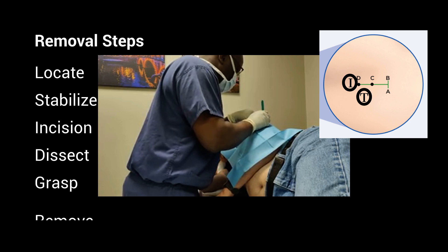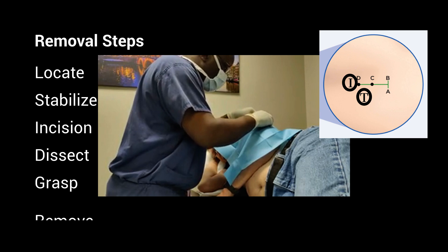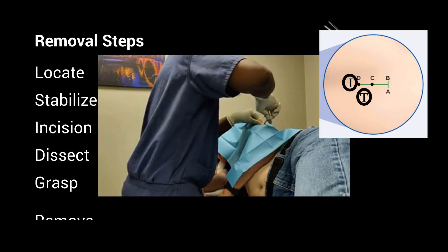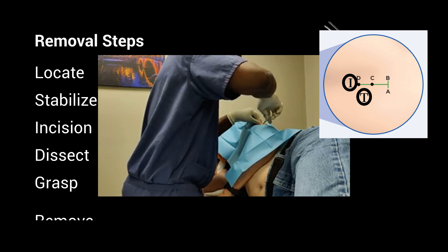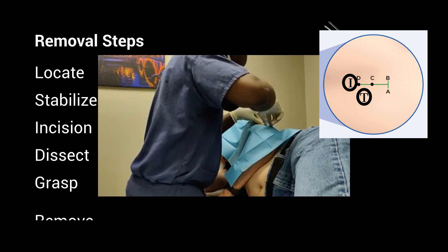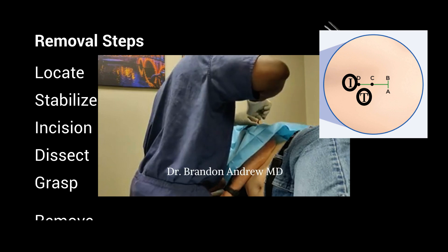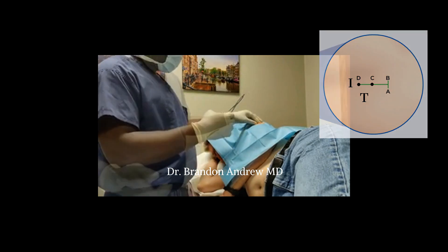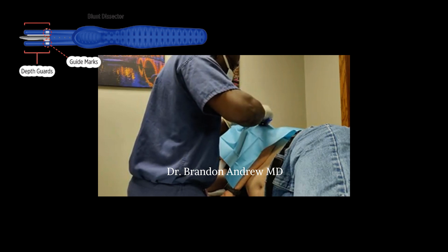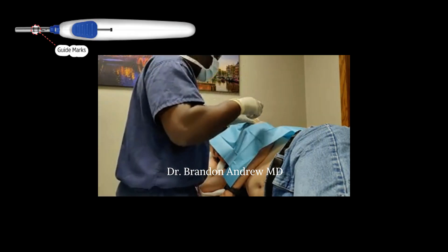Make your incision just beyond the distal edge of the sensor. The incision needs to be about three millimeters away from the base of the sensor so that you can dissect down into the pocket and grab the sensor at its distal end on its long axis, similar to how it was placed. Next, use the straight clamp provided in the Eversense insertion and removal bundle. Dissect down gently through the tissues to the pocket. It's very important to keep your index finger and thumb firmly against the sensor to help you control and keep track of the end of the sensor, which is your target. Once you get the jaws of your instrument around the sensor, firmly grasp it — you may need to rotate your wrist as shown to remove it. Insertion of the new sensor follows the steps shown previously and can be done in the same pocket from which you removed the prior sensor. Many patients have had excellent signal and accuracy using this technique.